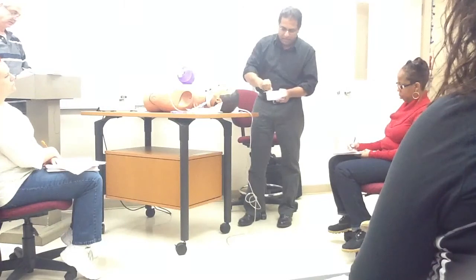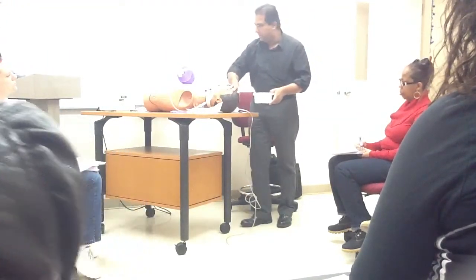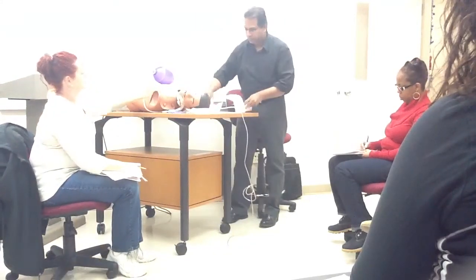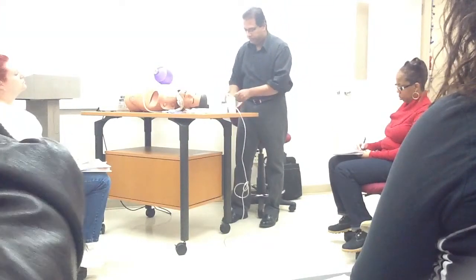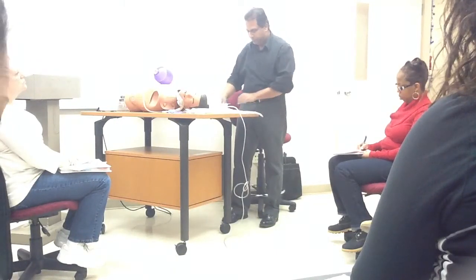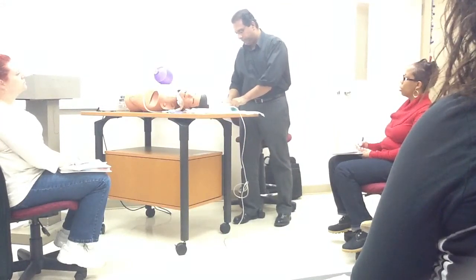Before that, you have to get this thing ready. This step is pretty much the same as what we showed you last week. How do you put the gloves on? This is not going to go on my hand. You don't want to touch the outside.